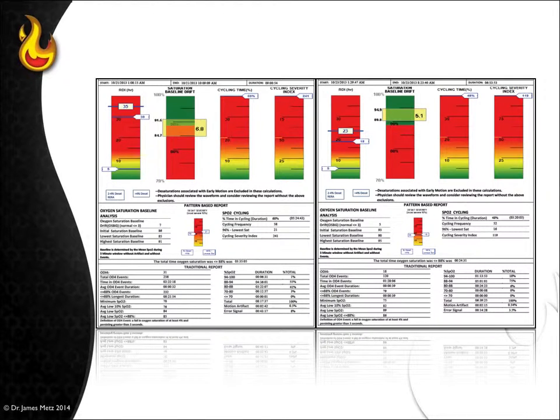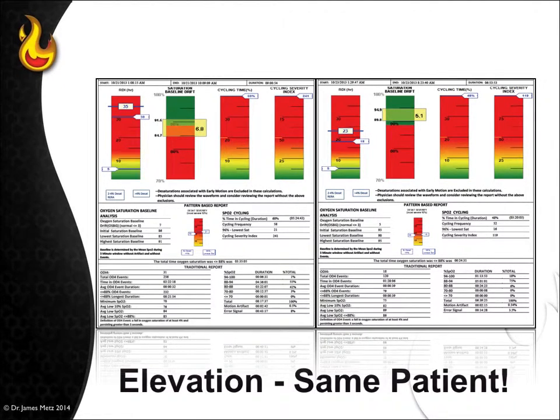Again, look at this. This is the same patient before and after, and that's elevation. So be careful of elevation. Be careful where the people are doing this. And people travel so much today. If they change elevation higher or lower, you're going to get a different recording, and ask them where they did the recording.